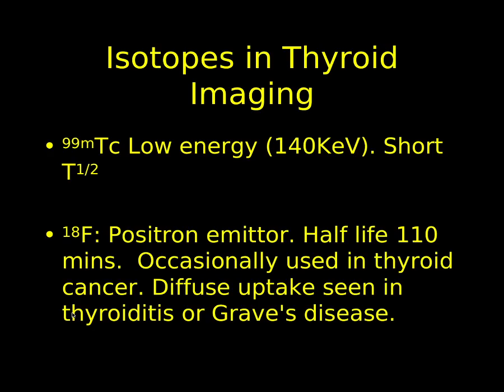So just very quickly to summarize, incidental uptake in the thyroid gland on FDG PET scans: diffuse uptake, think thyroiditis or Graves' disease. FDG PET scans, focal uptake, 1 in 3 possibility of being a cancer. Choline PET scans or other amino acid tracers, that's perfectly normal and we don't even need to comment on that.